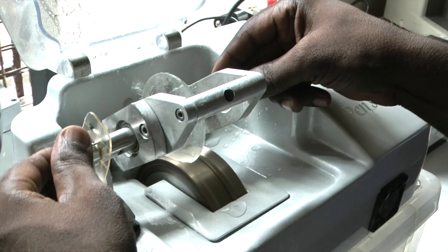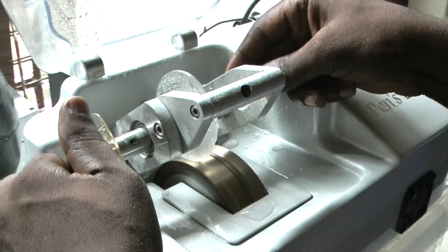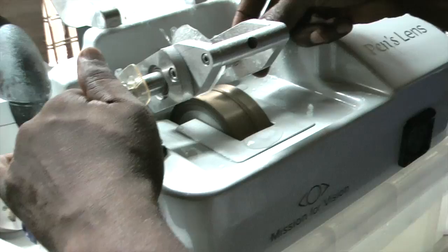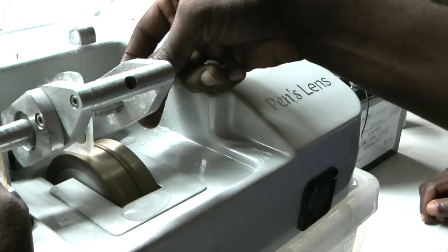It is possible to cut lenses without putting the lid down. We tend not to use the water guard because there isn't a lot of water splashing around, which means we can see a bit better what we're doing. Vincent is just moving the lens very gently around and the lens will slowly take on the shape of the former.